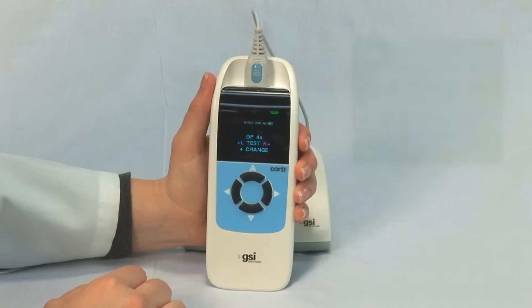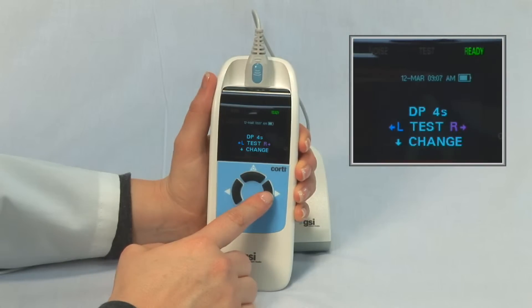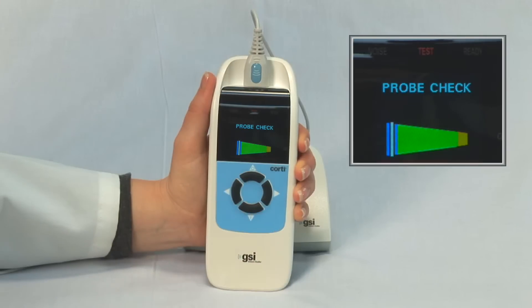When the test is started, a probe check window will automatically appear. The cone shape and color represents the ear canal. The white vertical line indicates the status and stability of the probe.